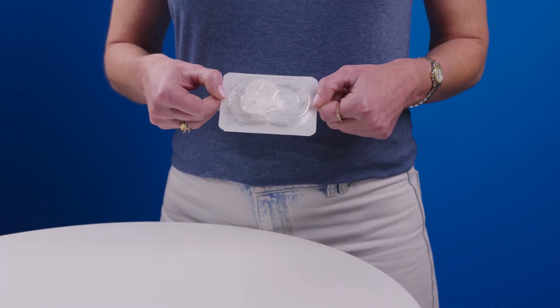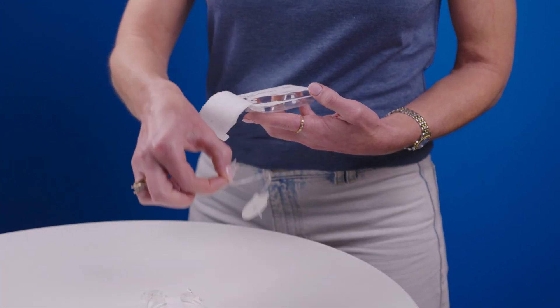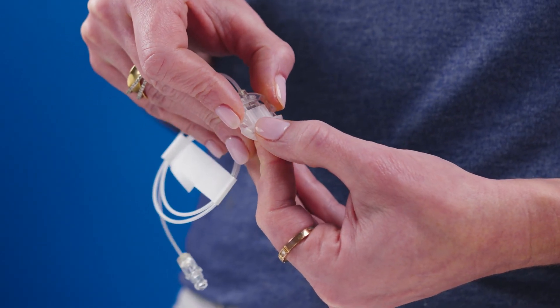Now, before you open the package, do a quick check. If the packaging looks damaged or has already been opened, grab a new one. Next, prepare the infusion set. Take out the two pieces of tubing and uncoil them. Remove the circular protective cap at the end of the long tubing by squeezing the ridges and pulling it off.